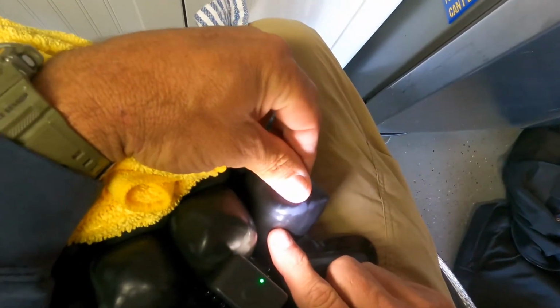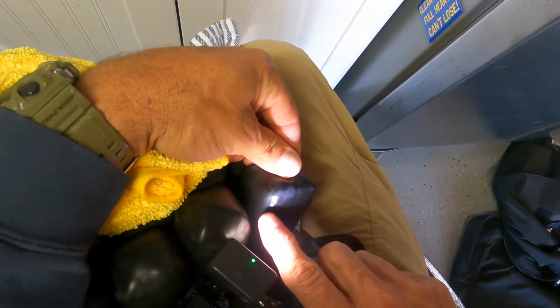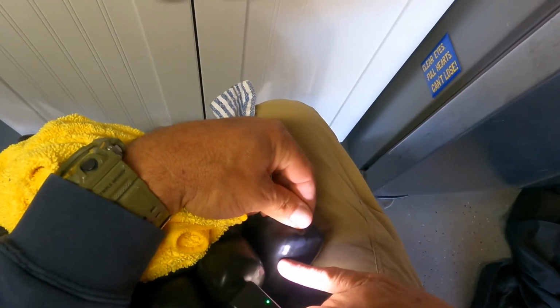So here's the hole, guys, right here. That little tiny crease right there where the light is, that's where the little hole is. Alright, so let's patch this thing up.